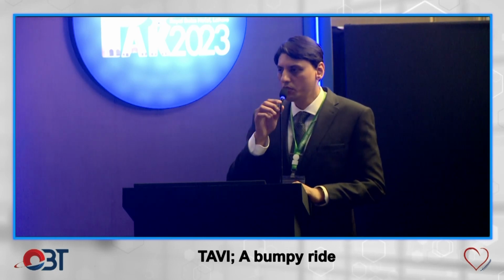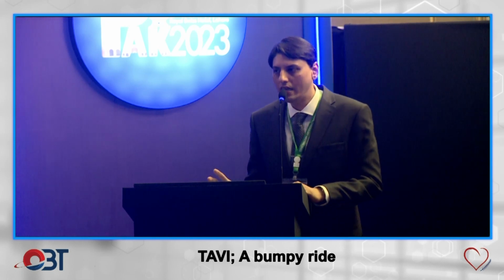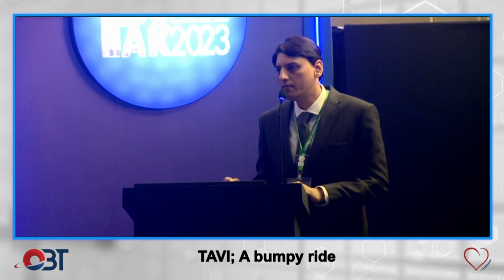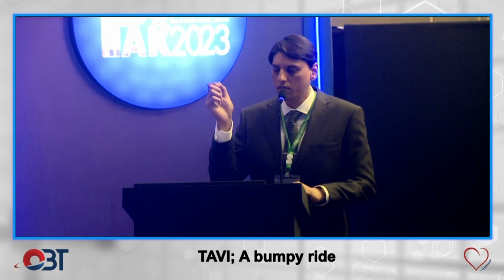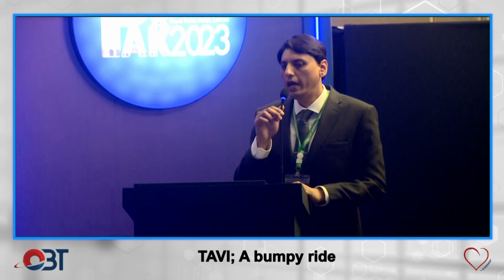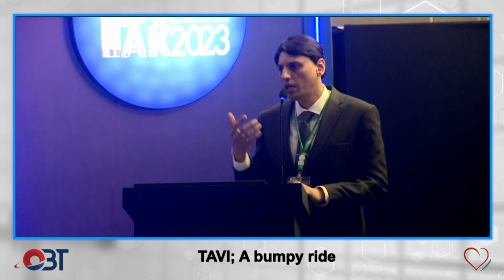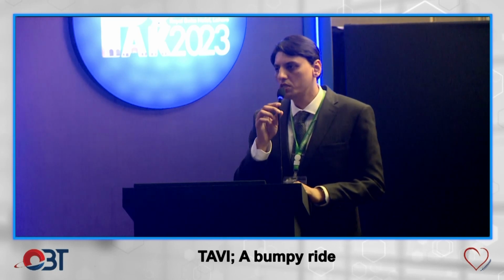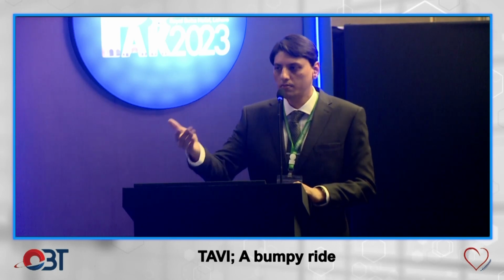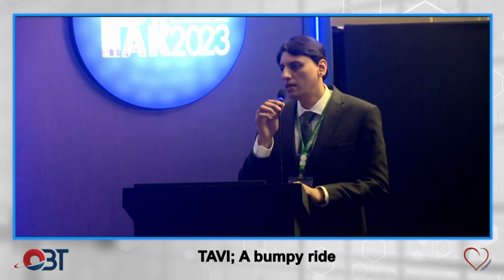Thank you, Dr. Ali Raza. On your point about the Lunderquist wire, the usual practice here at NICVD is that whenever we use a 34 mm valve, we cross our valve with a Lunderquist wire. And obviously, if there is extreme tortuosity, abdominal aortic tortuosity, we use a Lunderquist wire. So it's a usual practice. Might be different from PIC, might be different from NICVD and other centers.